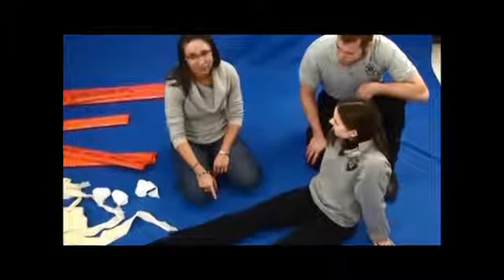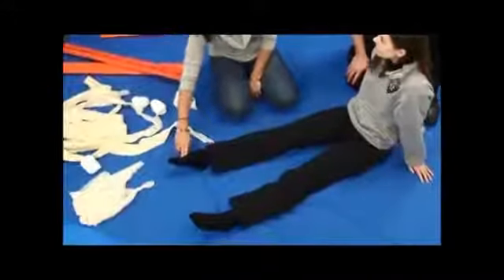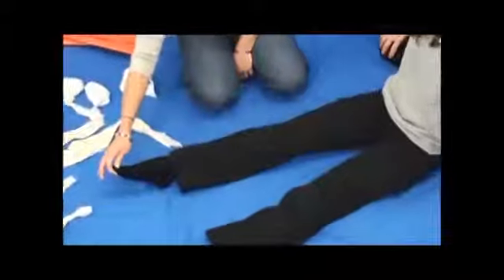Now we're going to splint a tib-fib fracture, which is the lower leg. First thing we're going to do is check pulse, motor — wiggle your toes — and sensation. Can you feel me touching? Yes. Which toe? Big toe. Very good.